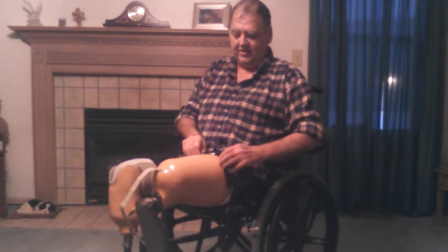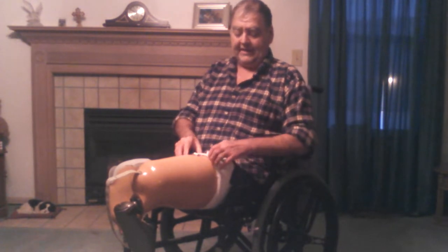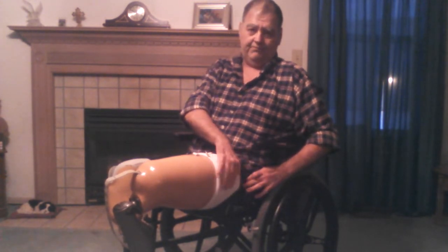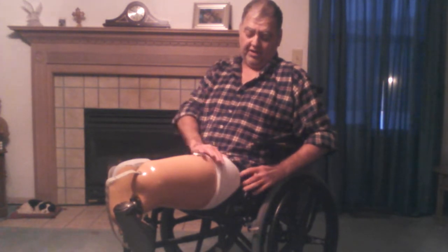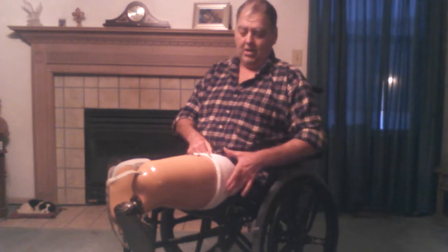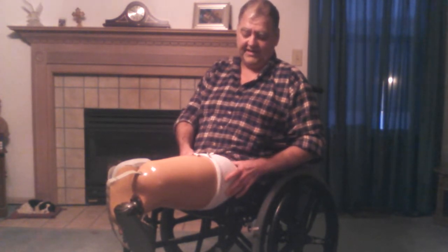It just pulls the whole thing down just a little bit. Then I'll start to pull this leg off just about four or five inches. And then I take these socks that I have doubled over the top of the shell. I was told early on — and it made a lot of sense and it seems to have worked out for me — that if this is folded up over the shell, it keeps the socks in place. It keeps them from getting sucked down into the prosthetic leg and causing wrinkles and things of that nature.